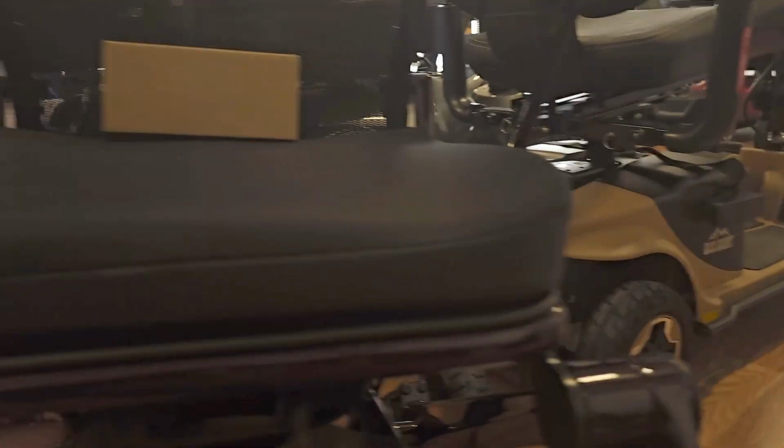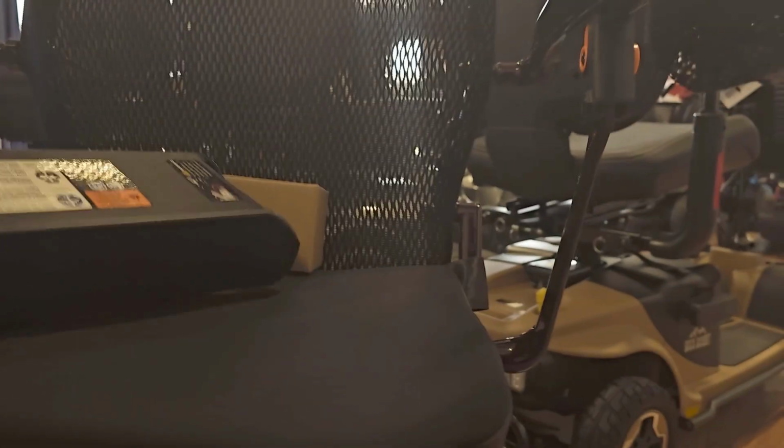But then you have power chairs. I'm going to show you an example here. So this has a removable battery pack. I'm doing this with one hand, so bear with me. So here is a great example of not all units have circuit breakers. So in the event of a power failure on something that does not have a circuit breaker, you might want to look into a few other reasons why this could be happening.